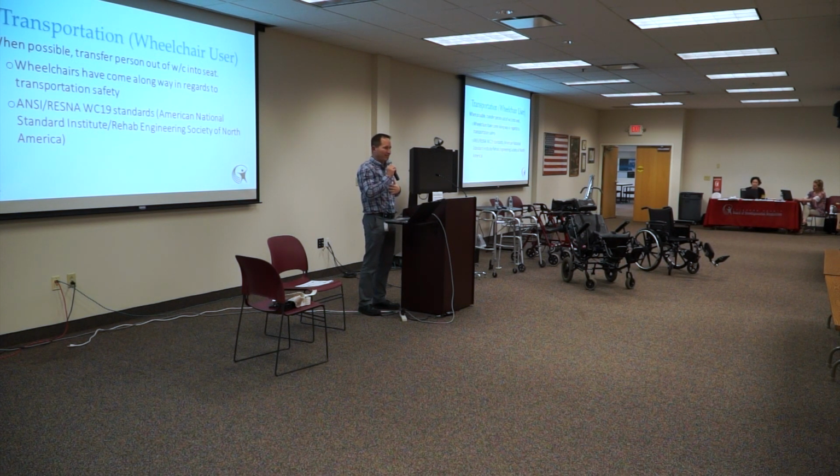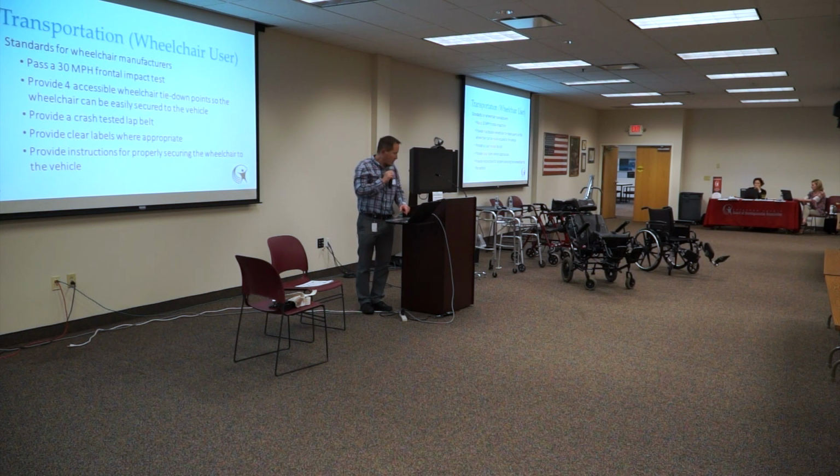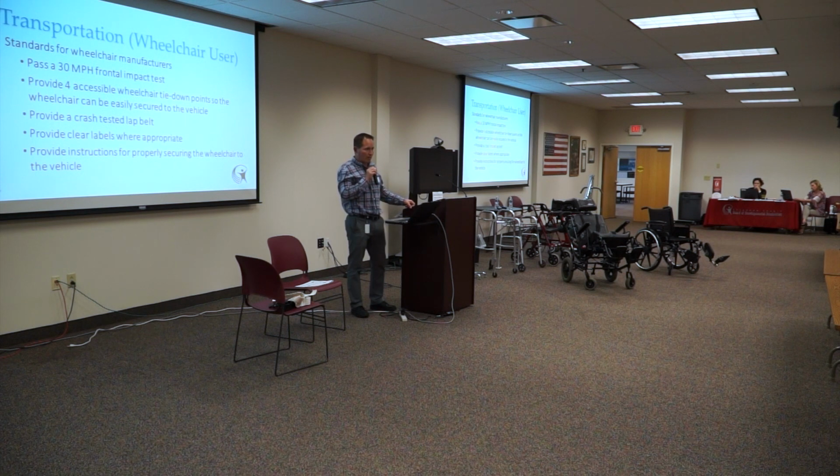WC19, has anybody heard that term? There's standards that RESNA and ANSI here on the screen set for manufacturers of wheelchairs to try to make them safer for transport. And a lot of manufacturers now follow these standards. One of those is, and I'll show you, actually I don't think this has it, the transportation brackets. That was something that the WC19 standards recommended, and a lot of times now our wheelchairs will have those brackets.